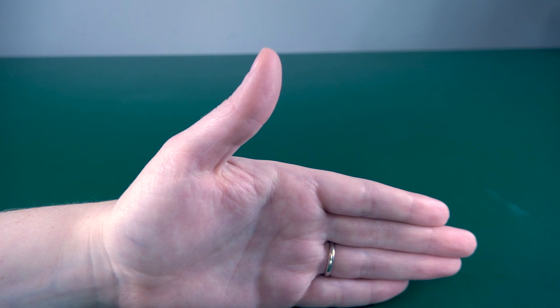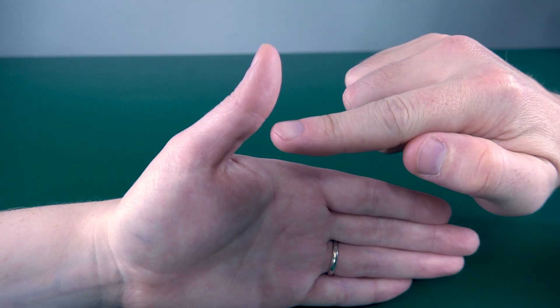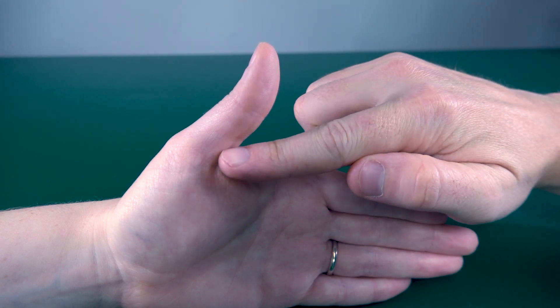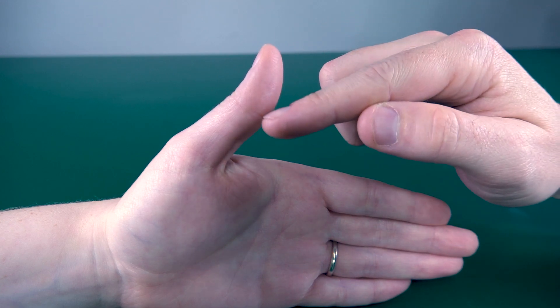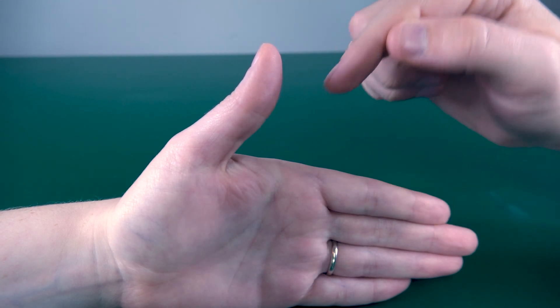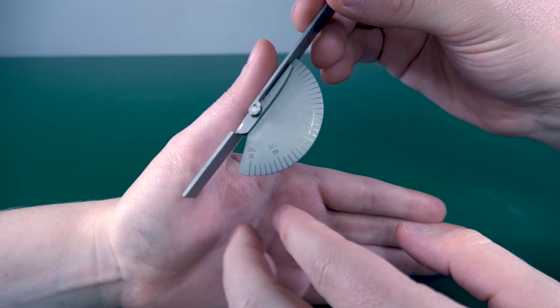Measuring thumb IP hyperextension: you want to have your stationary arm of your goniometer on the proximal phalanx, your movement arm on the distal phalanx, and your axis on the IP joint itself — like this.